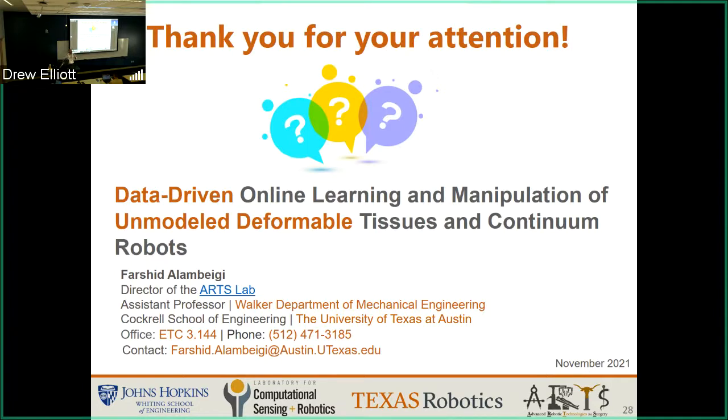Whatever video that I showed you, everything was online. But the key is that we are iteratively learning, and all our learning depends on the history that we have. So the Broyden operator we are using has two terms. The first term is the previously learned Jacobian, added to a change to that matrix. Everything is online, and we are showing that it can capture the deformation very quickly.